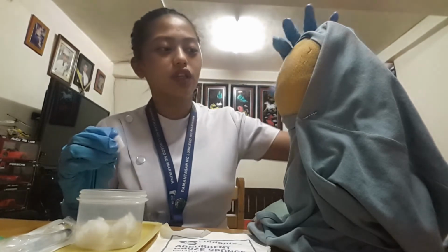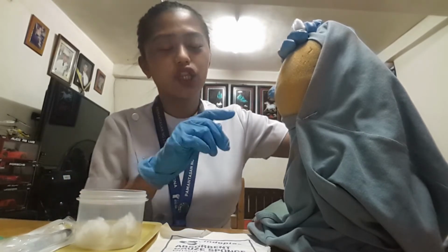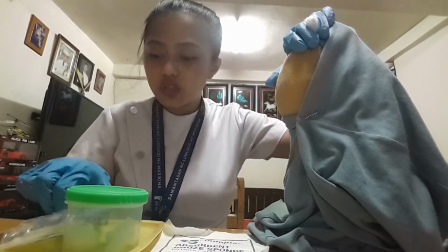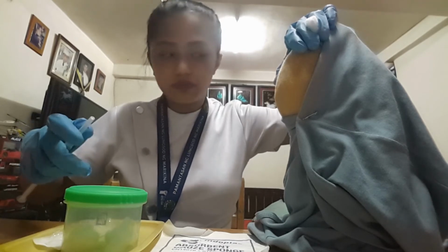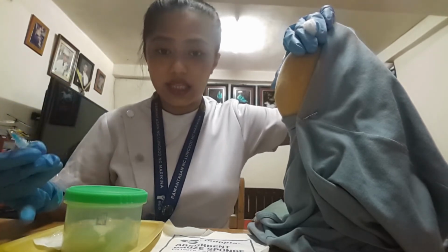After that, we need to place and hold the swab between the third and fourth finger. So 1, 2, 3, here, between the third and fourth finger on the non-dominant hand, above the intended site. And then we need to remove the cap of the syringe while waiting for the antiseptic to dry. So we have to pull the cap, preventing cross-contamination, and then dispose of the needle cap.